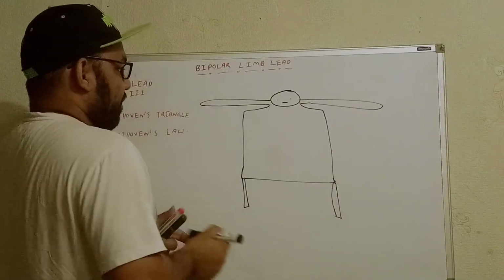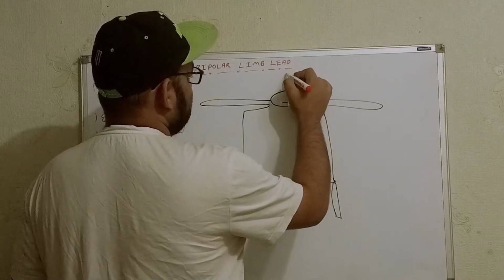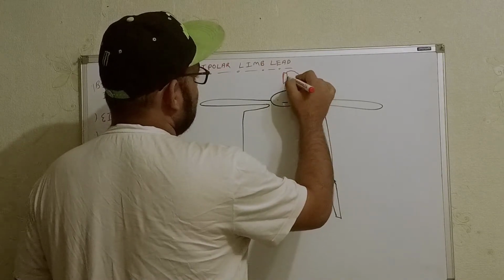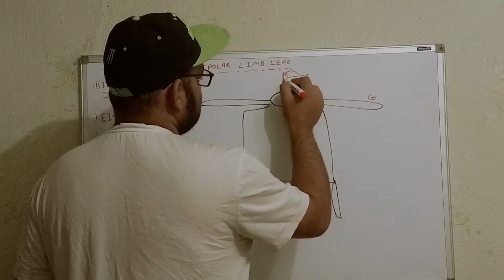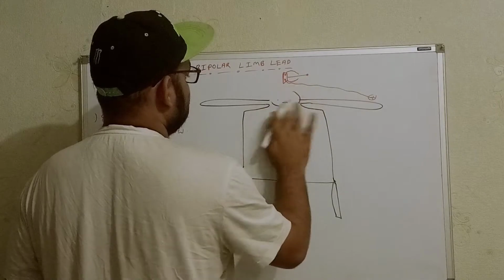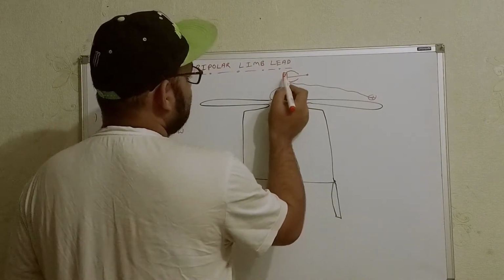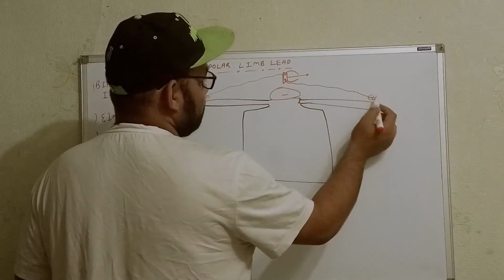Now, I already talked about how we can make the circuits. For example, there is the galvanometer over here, connected through these two points. One point will get connected with the positive electrode. Another will get connected with the negative electrode, in the right wrist. And this is the left wrist over here.